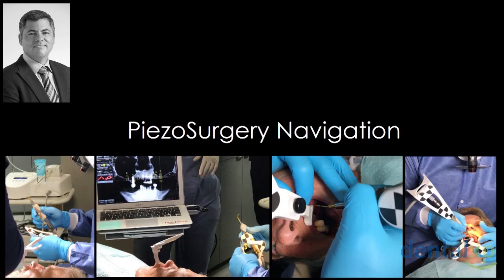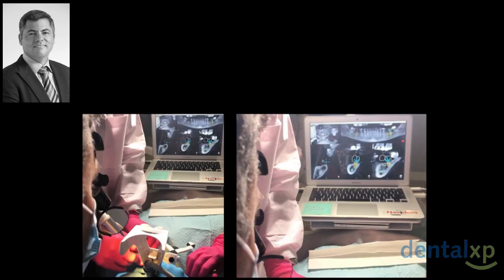And the last part to finish is the advances that we're doing now, utilizing other technologies, especially in piezosurgery. In piezosurgery, you can calibrate your piezosurgery device, placing one of these devices into the handpiece of the piezosurgery. The only difference that you're basically getting is that instead of getting all that target point, you're going to get a blue arrow. And the blue arrow is going to indicate where you are, and it's going to give you the indications in the different CBCT areas. Sagittal, coronal, axial. You're going to be able to see it everywhere.